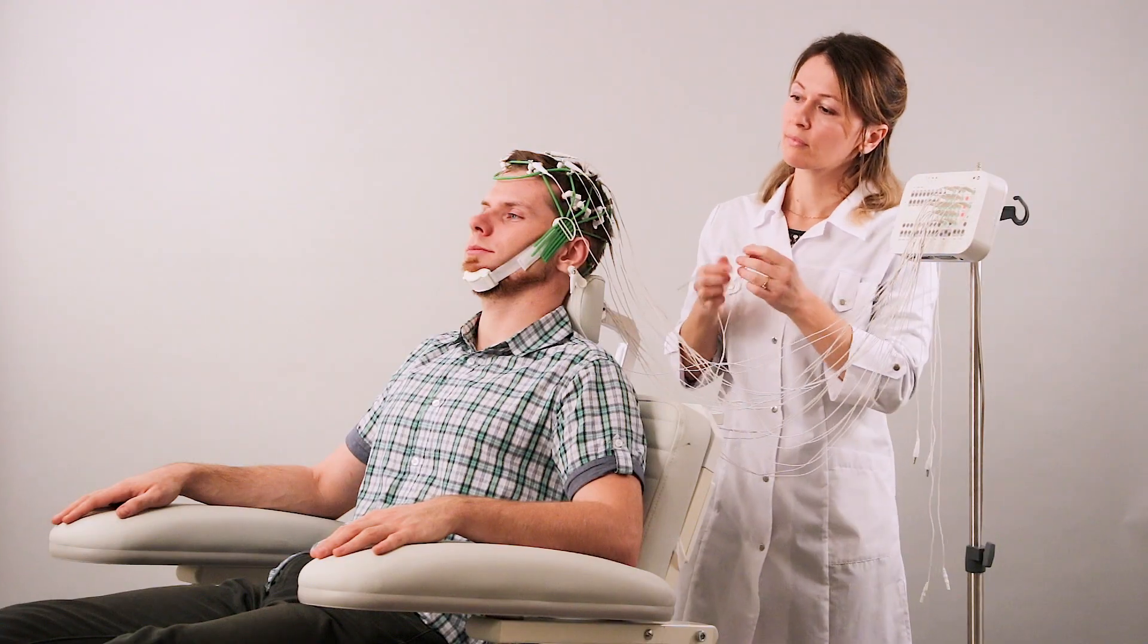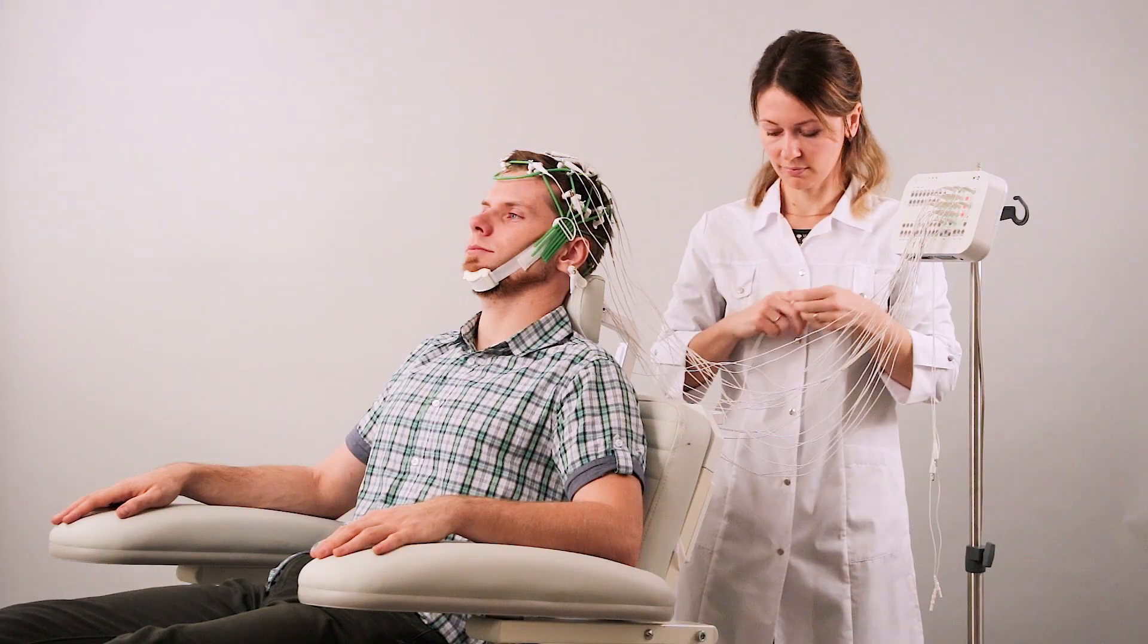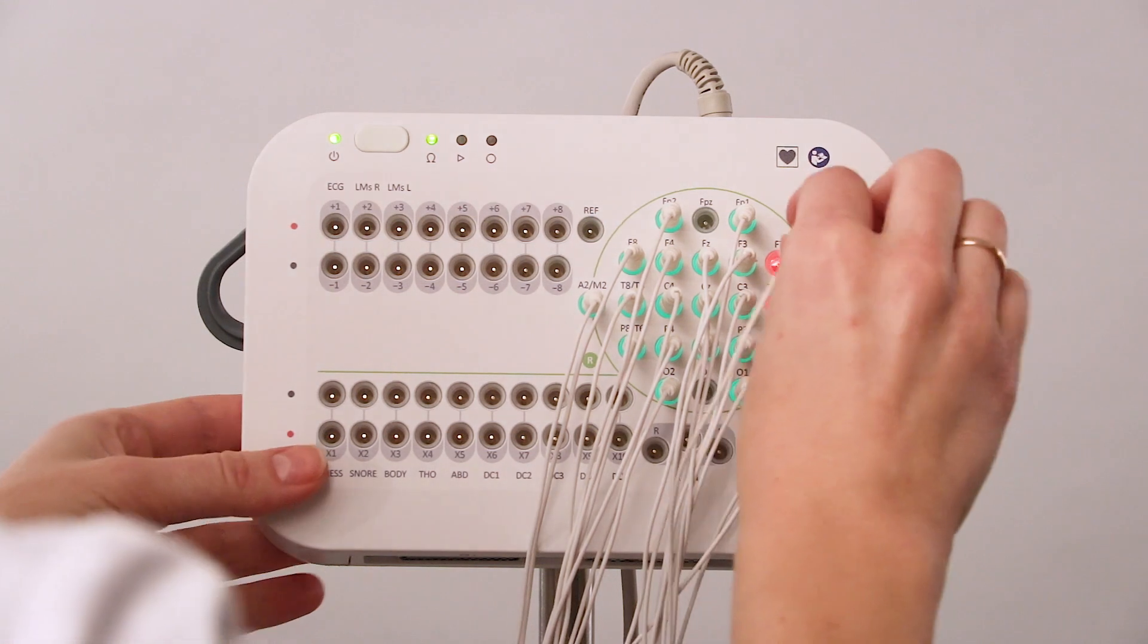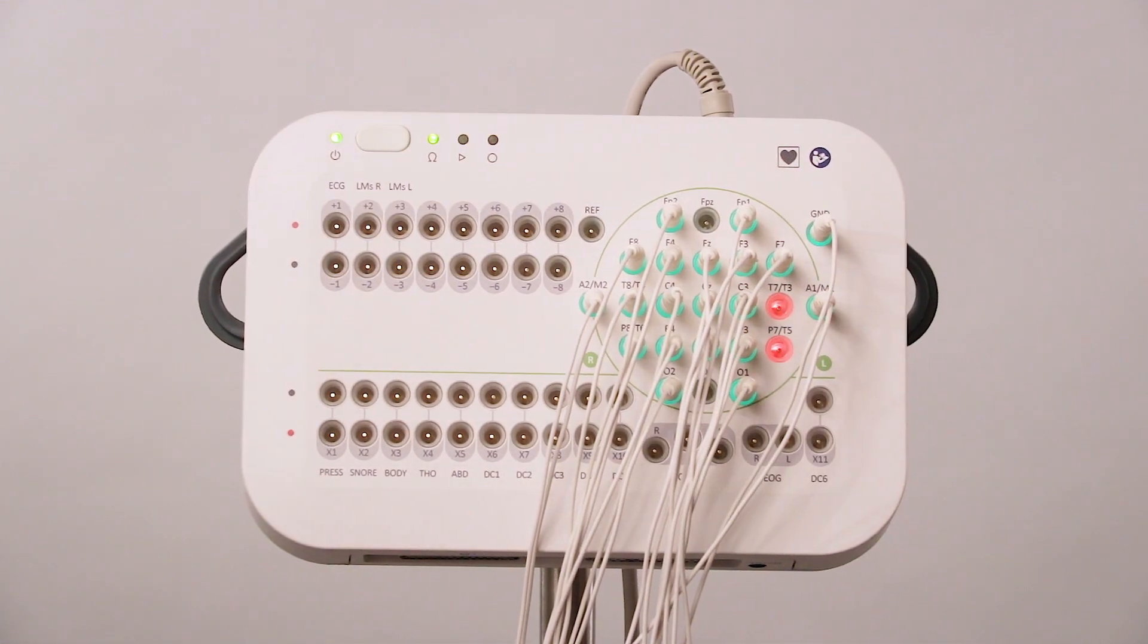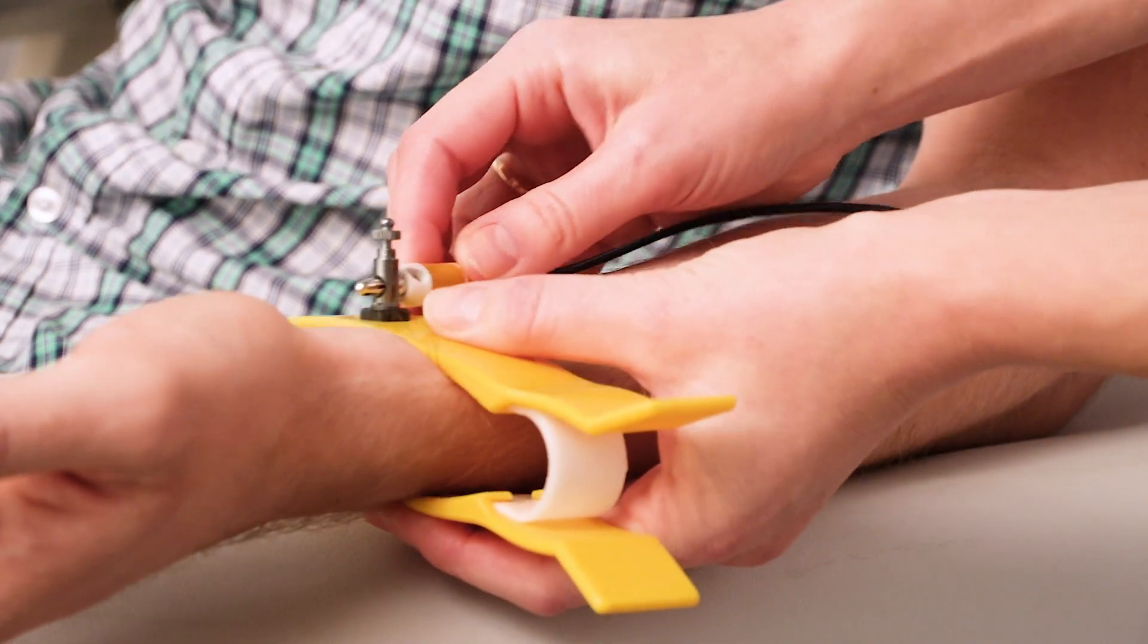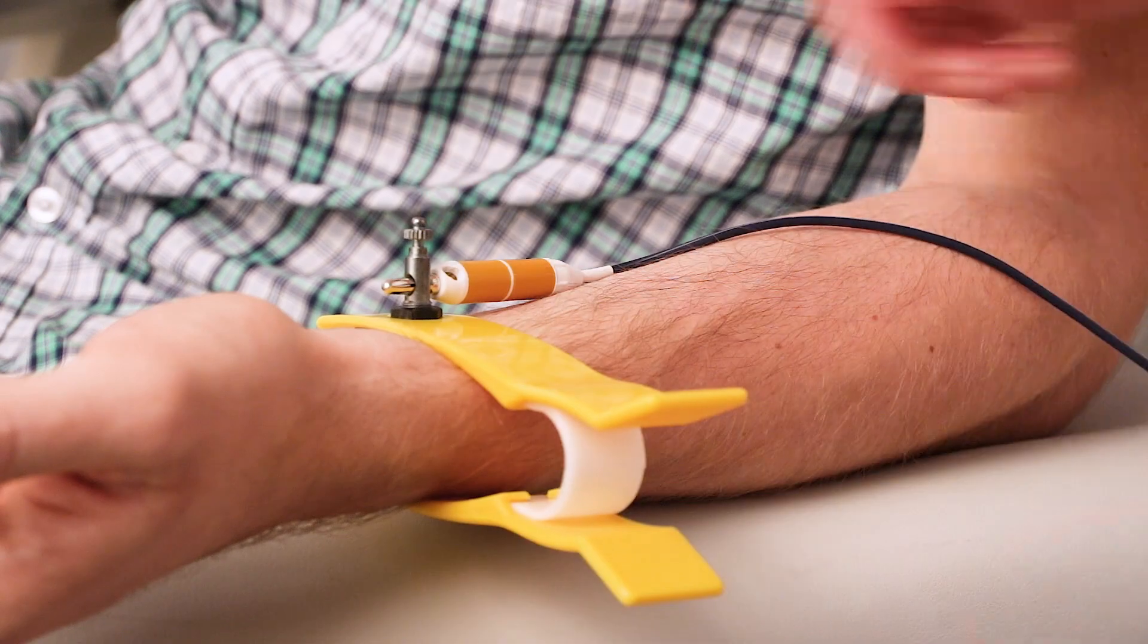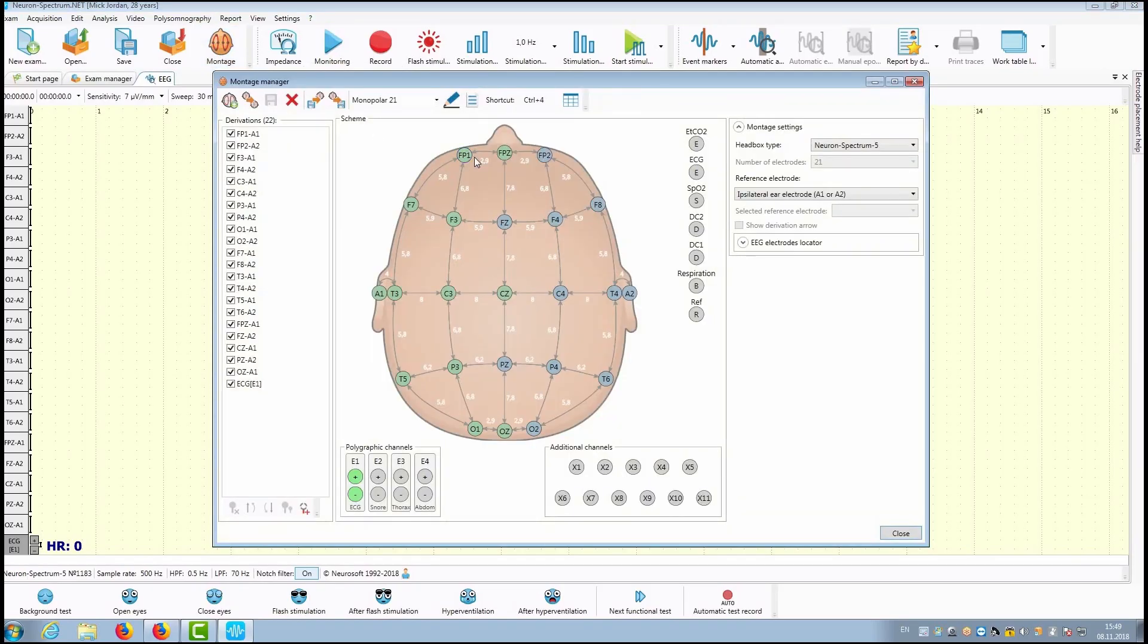Getting started is fast and easy. Place bridge or cup electrodes on the patient's head or use electrode cap. Put the ECG electrodes on the patient's hands. Check the impedance. Open the NeuronSpectrum.net program. Choose the montage and start EEG acquisition.